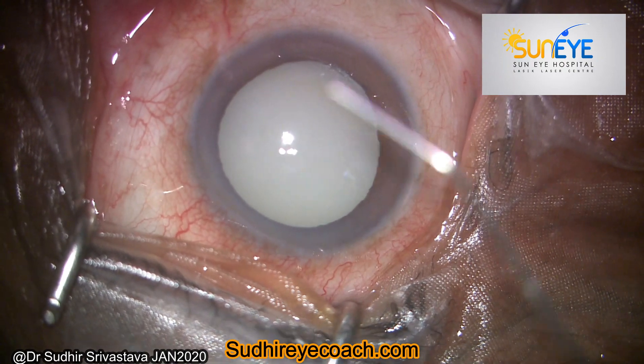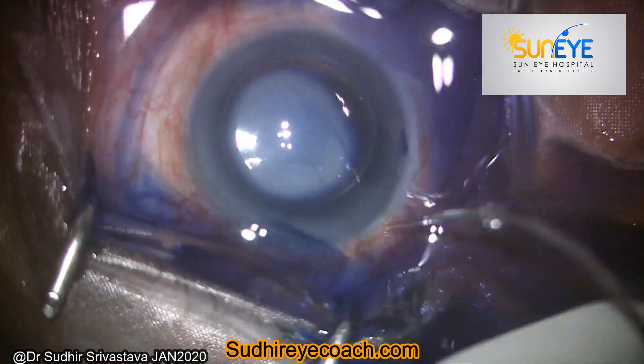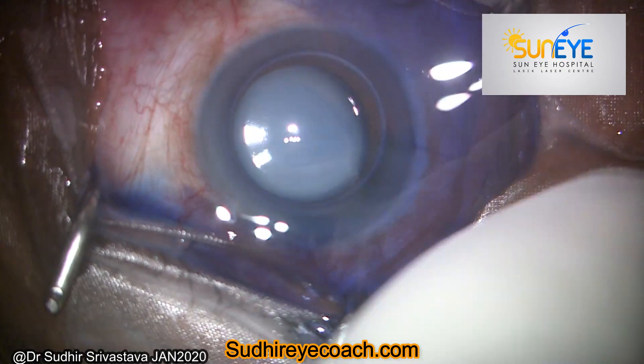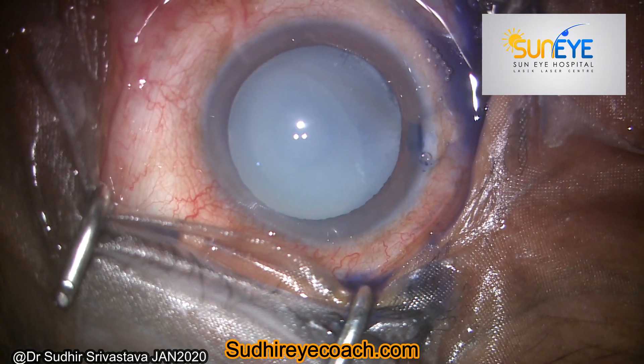In Morgagnian cataract there is total liquefaction of the cortex, which allows the nucleus to sink inferiorly. Since the cataract is hypermature and there is no cortical glue, always stain the capsule with trypan blue and fill the chamber with high viscosity cohesive viscoelastic.